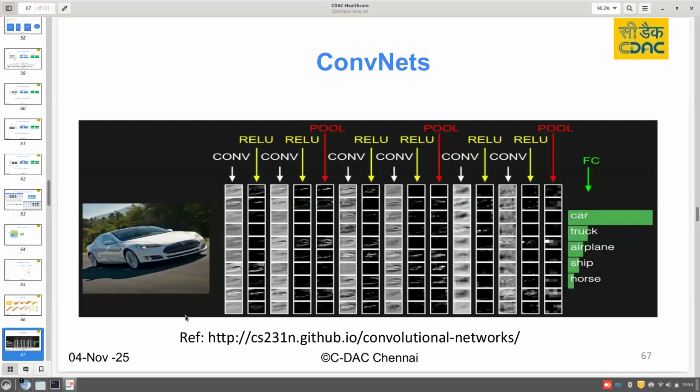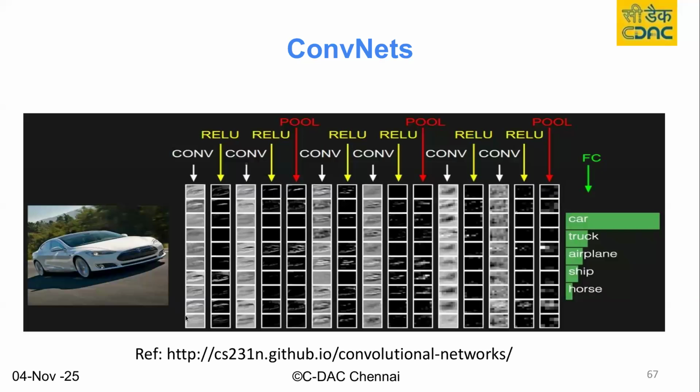In today's presentation, I have briefly covered what the kinds of chest X-ray are, what the medical applications of medical imaging are, how an image looks like for a computer, how X-ray image processing can be done, what kind of data sets are available for that, how to train on a data set using artificial neural networks or convolutional neural networks, how to do predictions using a pre-trained model, and how to visualize 3D images using DICOM and ImageIO libraries.